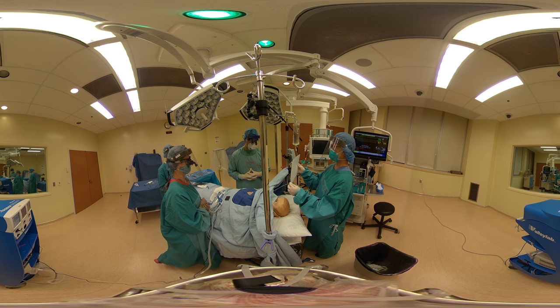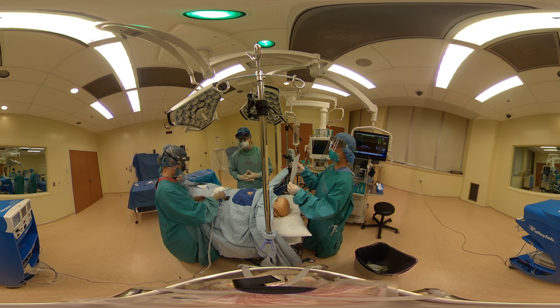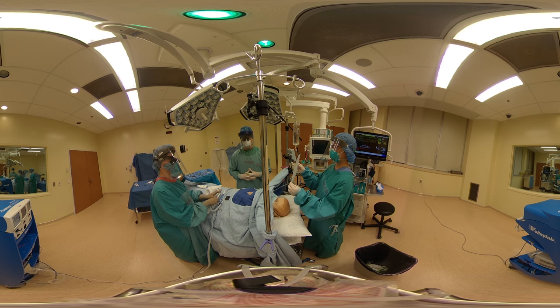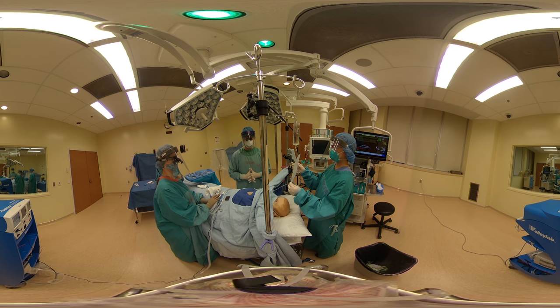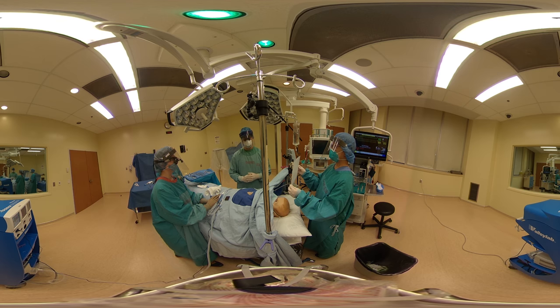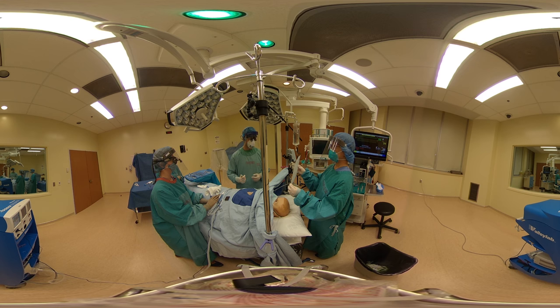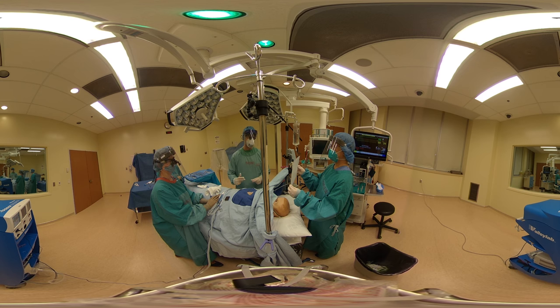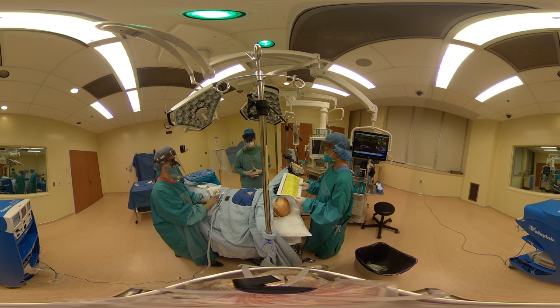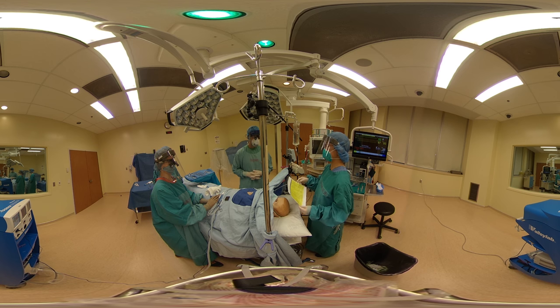Fire risk is a 3. To reduce the risk of aerosolized particles, we'll use judicious cautery, smoke-vac, and we'll discuss specific measures to reduce aerosolization and contamination of the room. Specifically, if the dissection and exposure of the trachea is favorable and the perceived ease of insertion of the tracheotomy tube is easy, then perhaps we'll paralyze once the trachea is exposed but before creating the actual tracheotomy window. If there are any accidental circuit disconnects, I'll immediately let the team know.